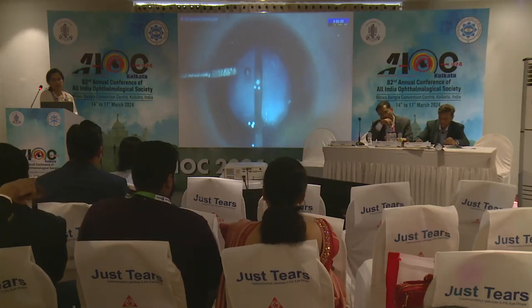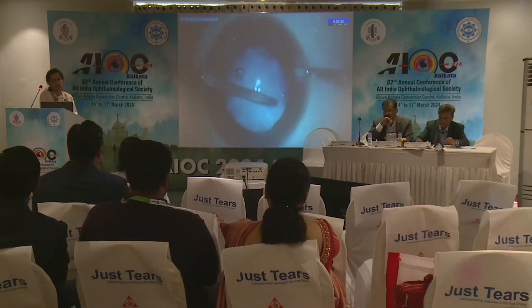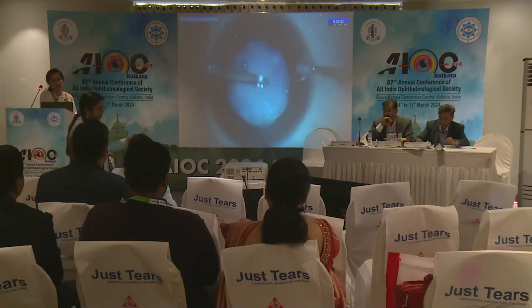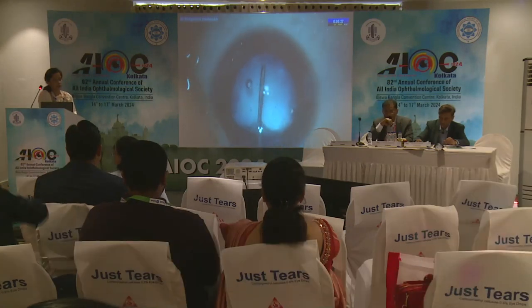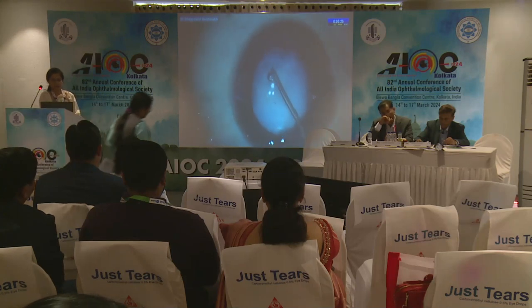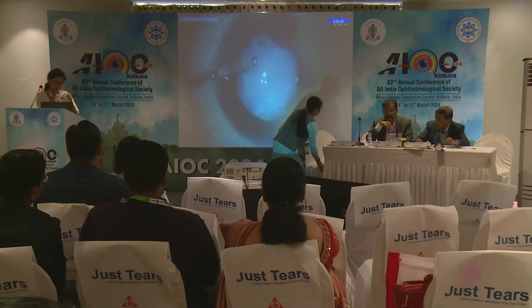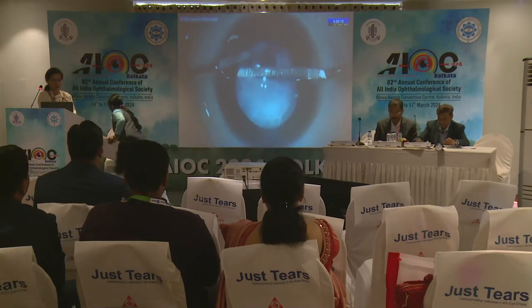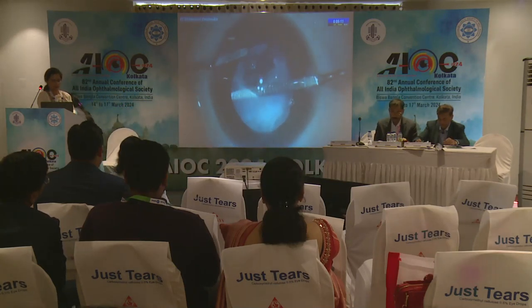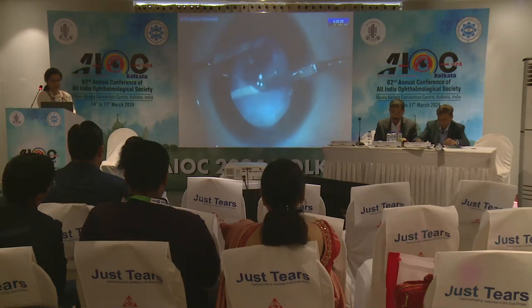Needs a lot of patience. Now, as you can see, there is enough space between the two layers, and finally the membrane becomes completely separated from the anterior capsule. It's free from its adhesions. Still, it is attached superiorly.